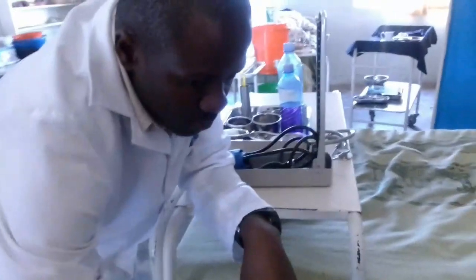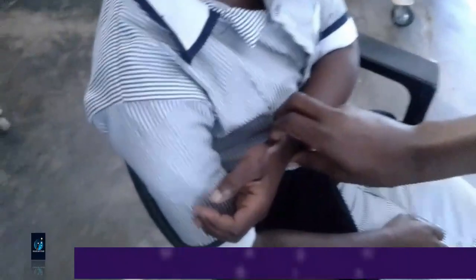Then after testing, you can put the patient's arm like that, so that you do two things at a go. When you place it like that, you can get the pulse and the respiratory rate. You can get this arm because our thermometer is here. So again, the thumb is here, the bone prominence is there, and you go just there. When you're comfortable that you can feel the pulse, you place the arm like that. Then you get your wristwatch or your nurse's watch and count for a minute. Okay, so I've started counting.